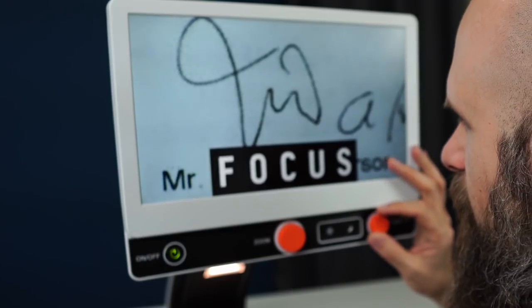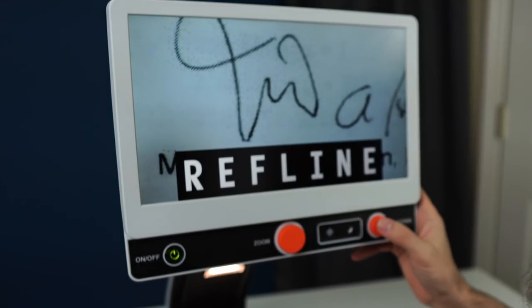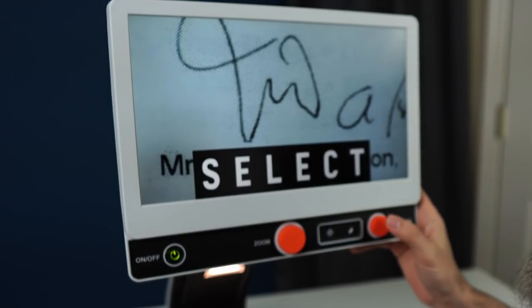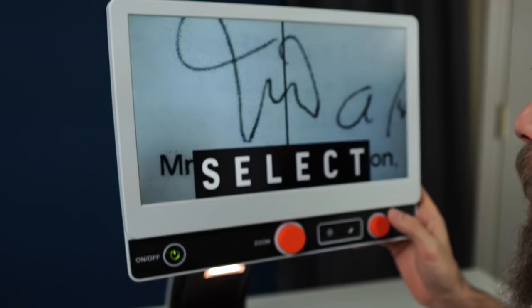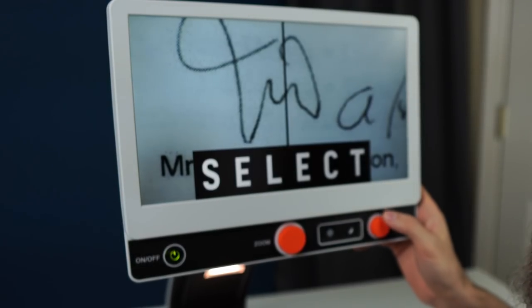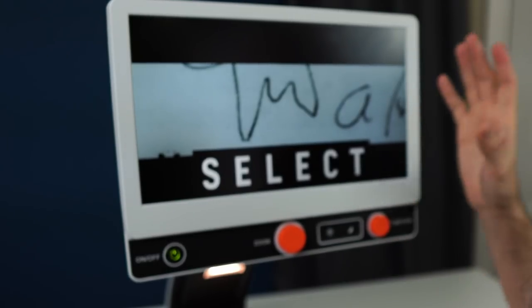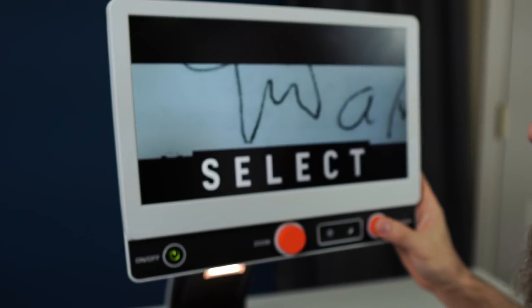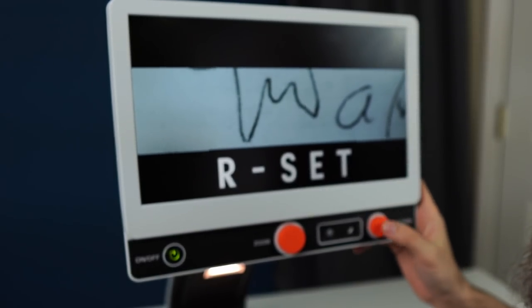So you can turn off autofocus and it won't do that anymore. We have a mirror mode — we'll come back to that in a second. There's a focus mode so you can set it to manually focus. Next we have all of our different guidelines. If I click on that I can cycle through all the different lines: horizontal line, reading line, vertical reading line. You even have these shades — some people call them the barn doors. If I click on it, now I can adjust it by spinning the function dial.